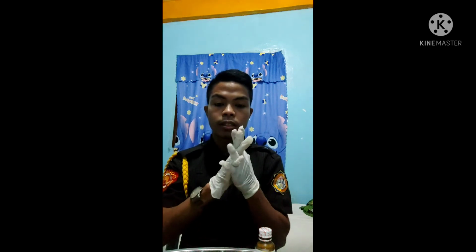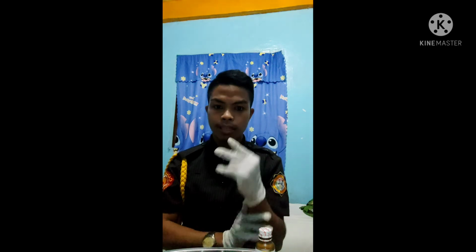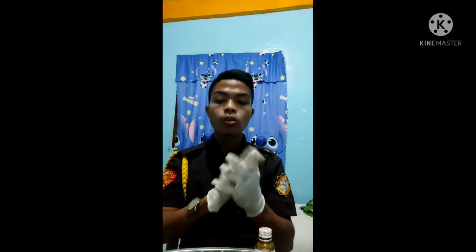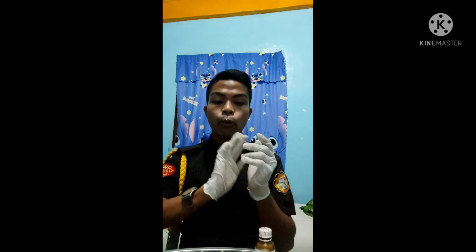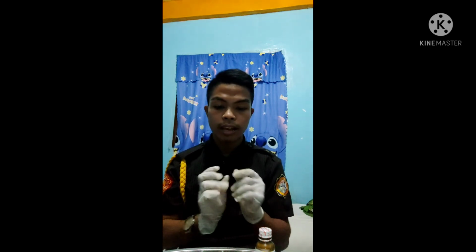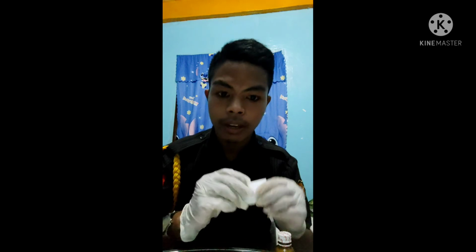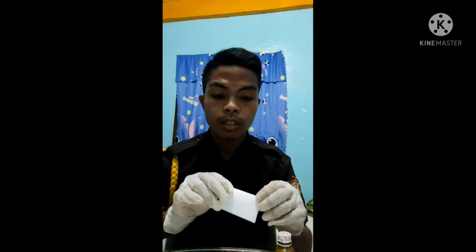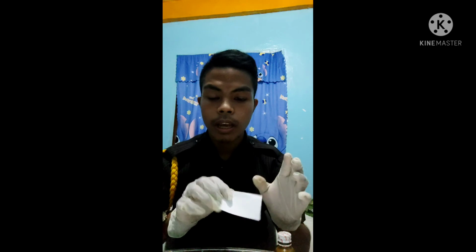We will proceed to blood grouping so that we can identify the blood group of these two samples we have tested. The first thing we need to do is place a blood sample of those two specimens on different types of slide. I already have slides here, for A, B and Rh.